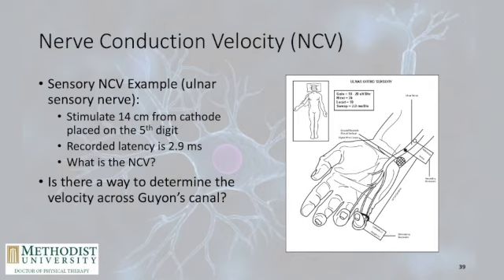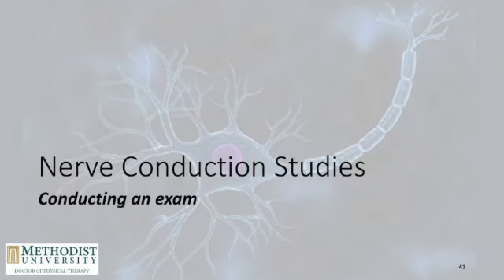Don't worry too much about the question at the bottom of the screen, but try to do the math problem, and what you should get is an example of nerve conduction velocity. So now we're going to get into more of the procedure behind doing a nerve conduction study.